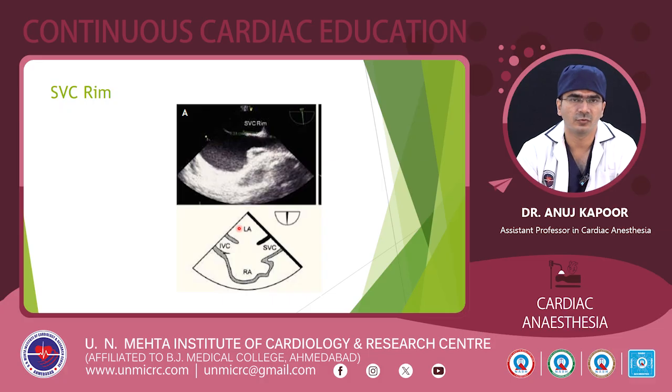From the mid-esophageal position, we rotate the probe to 90 degrees, and here we can see a view in which both the SVC and IVC rims are visible, and the SVC rim is to be measured from the superior lip of the ASD up to the insertion of the rim into the SVC.